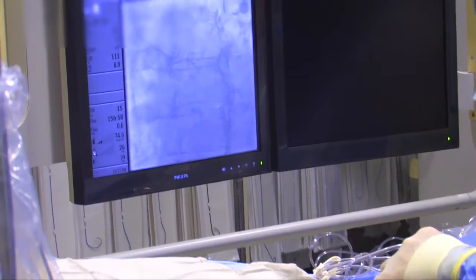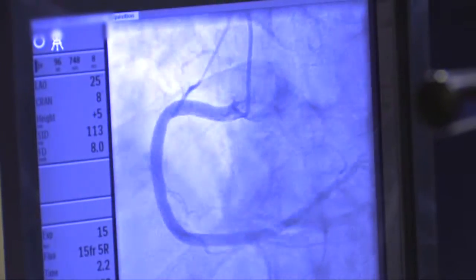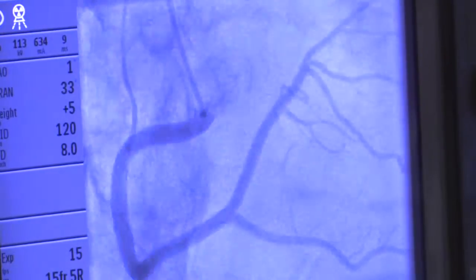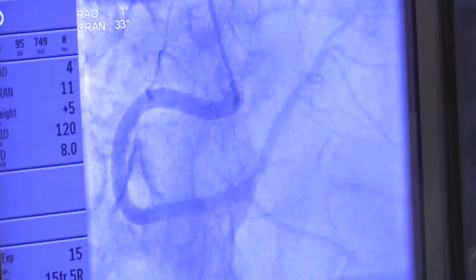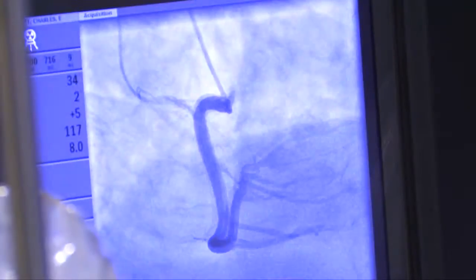We are in the artery now and we're going to take pictures at various angulations — you'll see on the monitor all the different angles we use. That's the right coronary artery. We're going to take a picture of that, and that looks clean — it's a large, normal-looking artery. We used to do these procedures from the leg, the artery in the groin, but we recently started doing it from the radial artery in the wrist. It's a little more comfortable for the patient, though sometimes a little harder to maneuver the catheter.